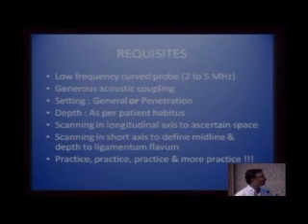And you should first scan in the longitudinal axis to ascertain the space. If you want to put in your needle in the L4, L5 space, as I showed you in the previous slides, you must identify that space. The next thing you need to do is you scan in short axis to define the midline and to identify the depth from the skin to the ligamentum flavum.